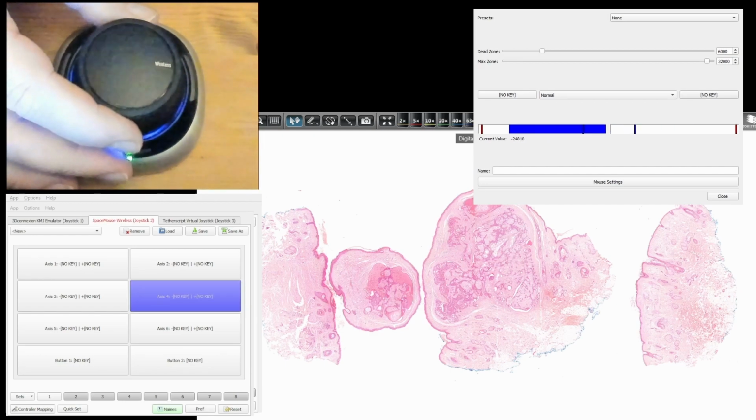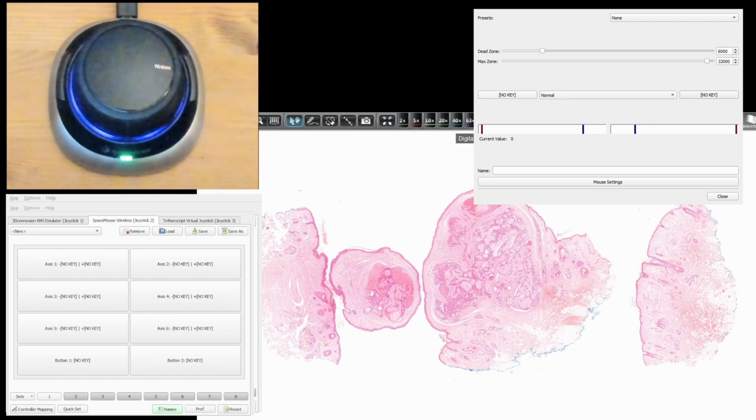When we are moving the mouse, you will see that the tracking to the left and right side will be translated to the appropriate keys. Above the scales, you have the left and right movement, or the up and down for that matter, where we can put our corresponding keys. The only thing we need to do is click on the no key button on either side and push the up and the down key on our keyboard. And that's the assignment done for this.